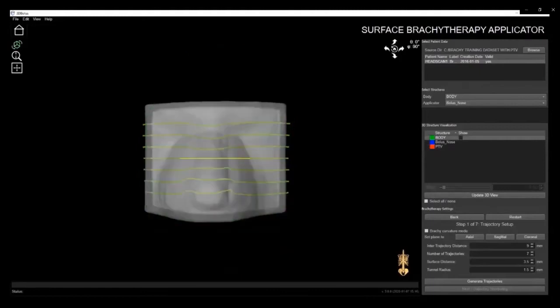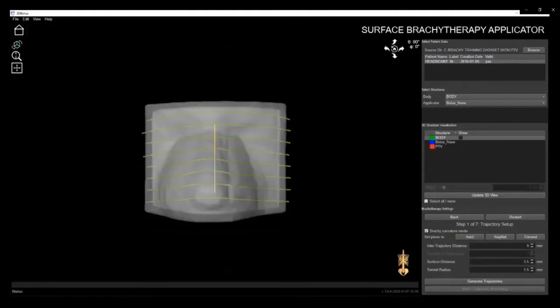Another new feature is the brachy curvature mode. This is useful when dealing with complicated anatomy that has a double curvature, such as a scalp. You can simply click the curvature mode, and our algorithm will accommodate for more complex cases.